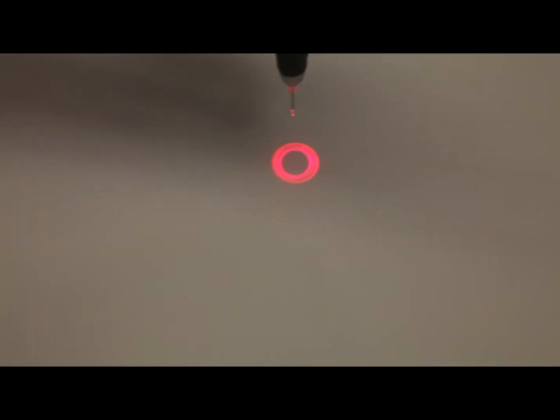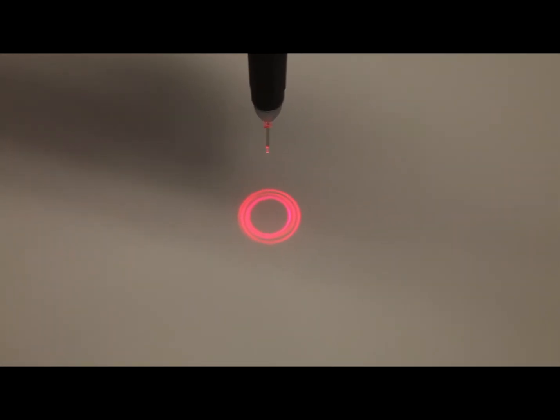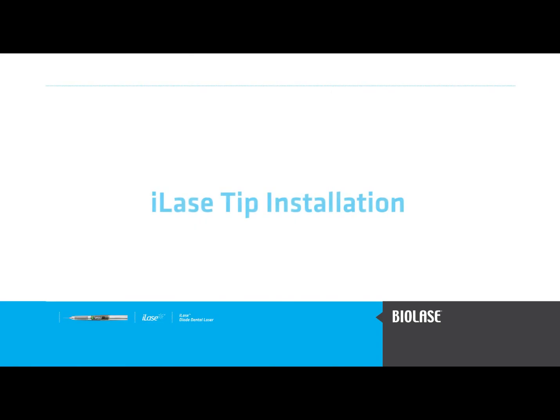Verify that the tip is properly inserted by making sure that the aiming beam produces a donut-shaped pattern. For more information, visit www.in00.ca.uk.